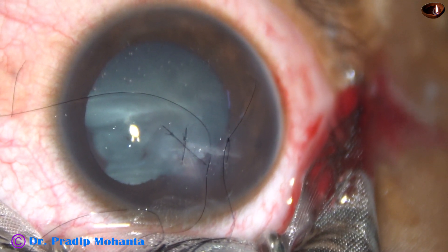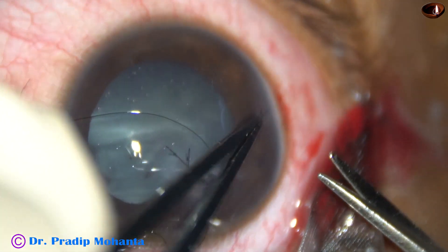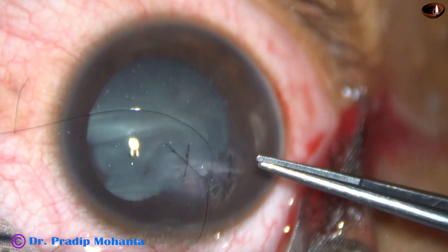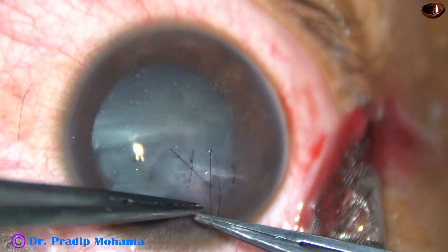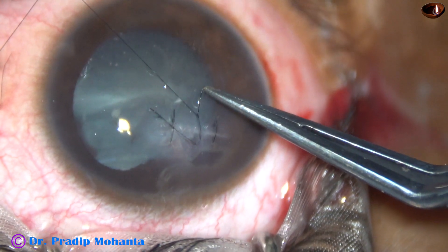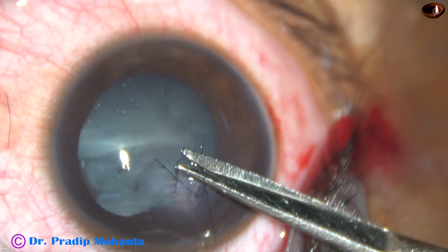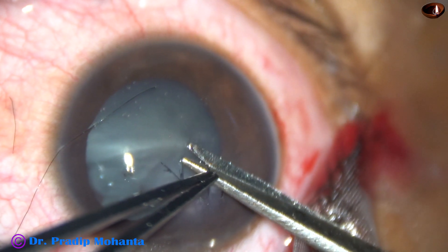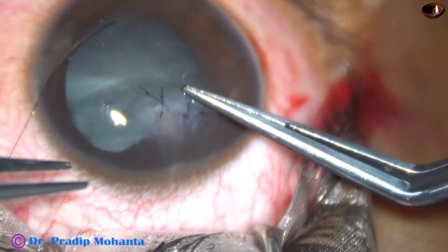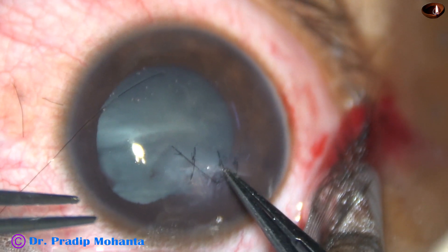It is done. The threads are trimmed close to the knot. As I try to bury the knot it gets buried easily. This is the third suture — 2 throws, then one more throw. As I try to bury the knot inferiorly it doesn't go in that direction, so I pull the knot superiorly and in the superior aspect it gets buried easily.